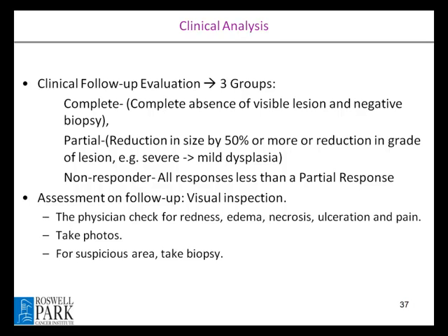That's one of the main problems. Also, the whole cavity is not really accessible for placing optical gadgets. That's the main limitation. Otherwise, like in mice imaging, you can do continuous measurements. That will be really difficult in patients, but I will talk about that later, and it may be very interesting to investigate.